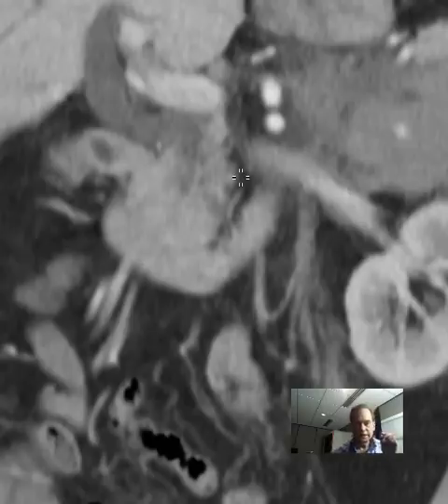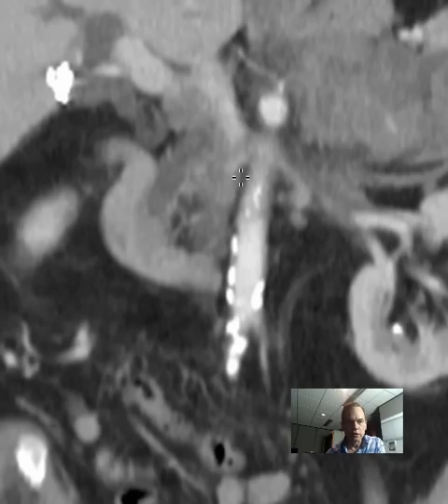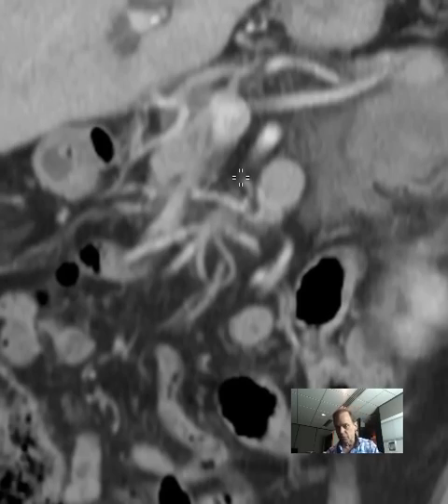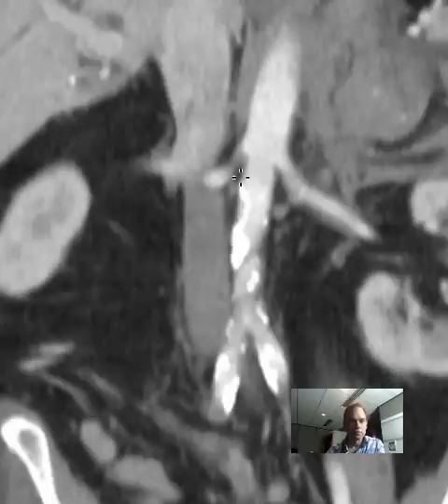Now, you have an idealized picture in your mind of what this anatomy is, and you will see that there's a tremendous amount of variation. So it's not the actual picture in your mind that you want. You don't want to see the way it's supposed to look. You need to have the concept of what the anatomic relationships are, and you will see that those anatomic relationships are fixed, but the exact appearance is highly variable.